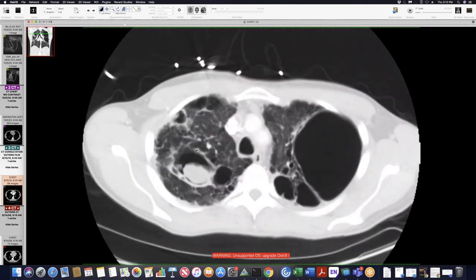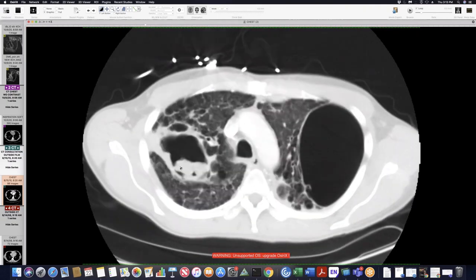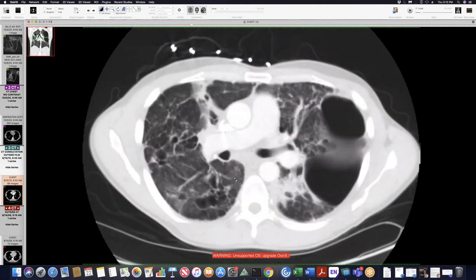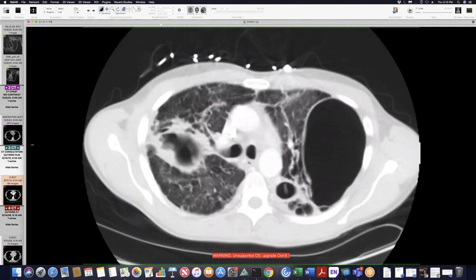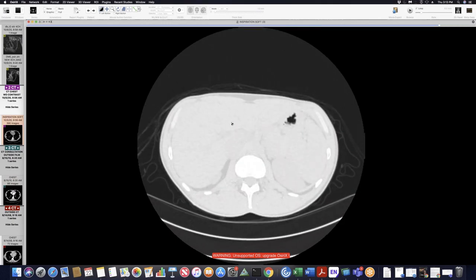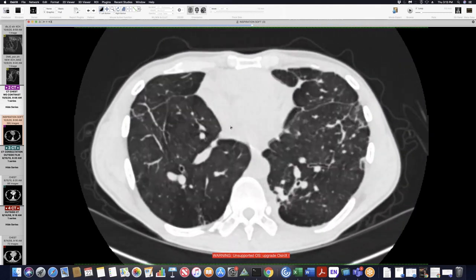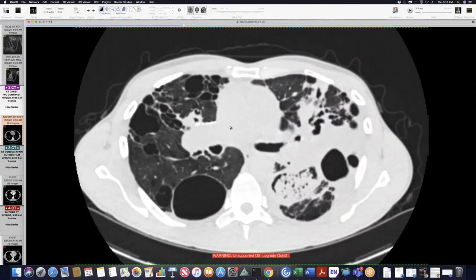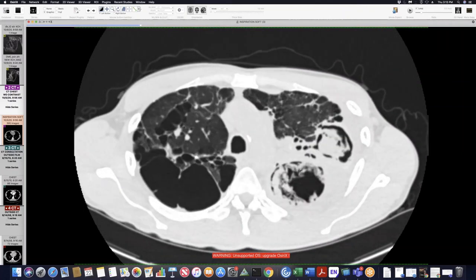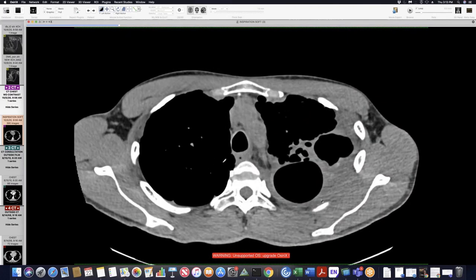So 7 years later, he has some cavitation up here, kind of a thickened fibrocavitary look. And he has a mycetoma. And so a lot of his nodules have improved, but he has fibrosis in his upper lobes. And then I will show the CT from earlier this month, so October 2020. In the meantime, I think a few years ago, his right upper lobe was resected for that mycetoma, which was obviously confirmed on pathology. So his upper lobe is gone, and then now in the left upper lobe he has mycetomas, and then you can kind of see this rind of tissue here.